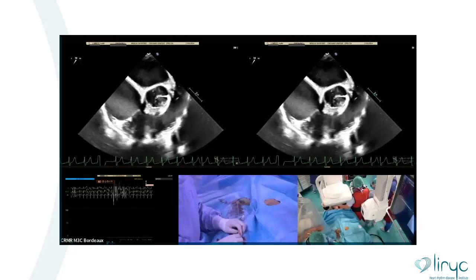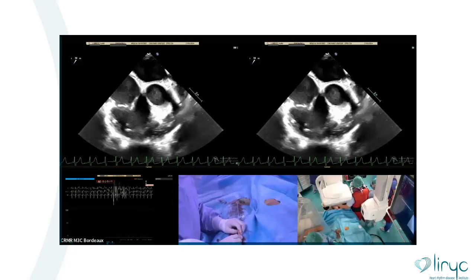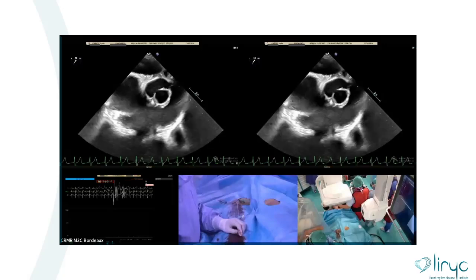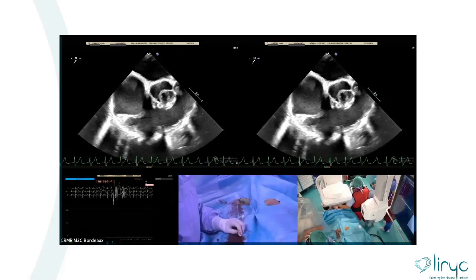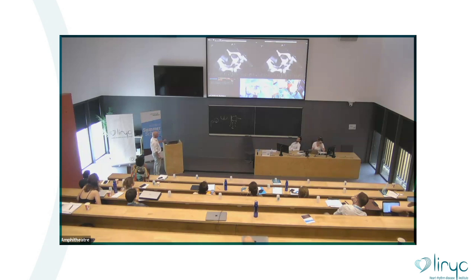So Mark, do you agree that we have passed the VSD and that we are in good position? Can you see the images? Yes, but I must say that the people in the audience didn't see the critical moment. And so there is the question, can you do it over again?